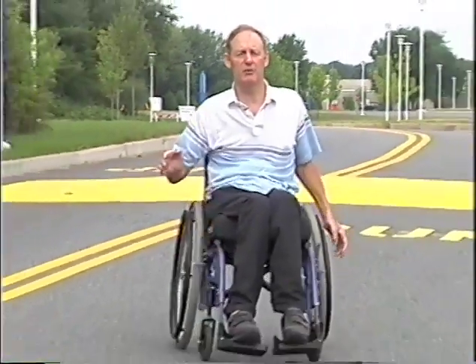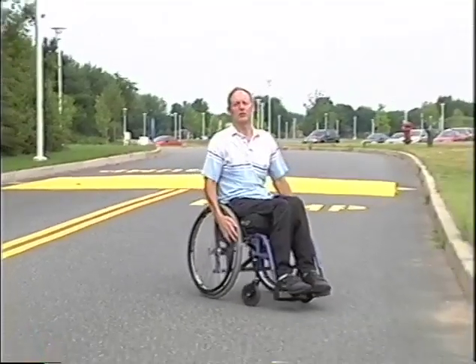When it comes time to making decisions about wheeling on uneven surfaces such as this street, you may want to think about trying to wheel on the crown of the road. If you stay here on the slanted surface, you can see that the chair is always going to be falling off to the left.